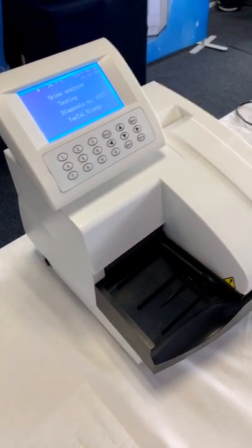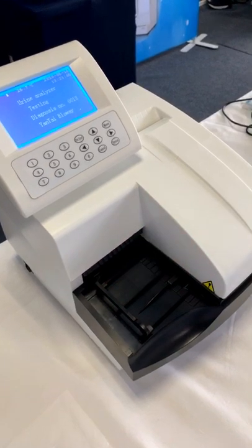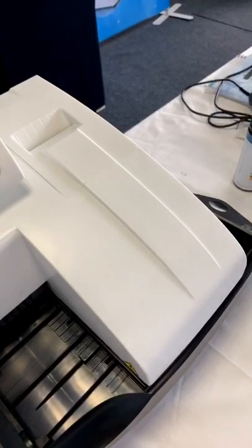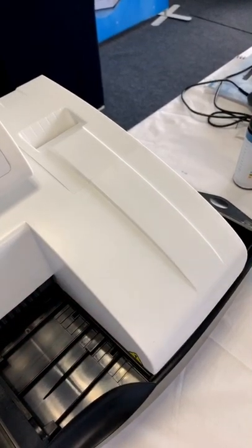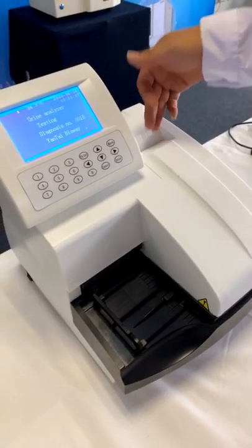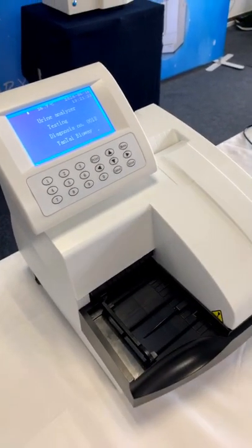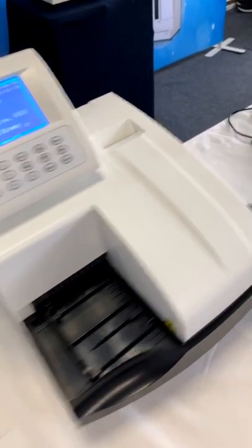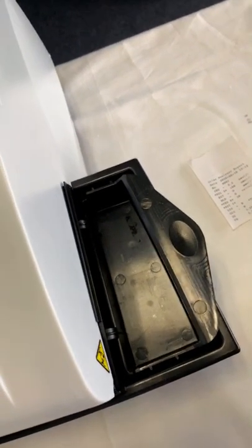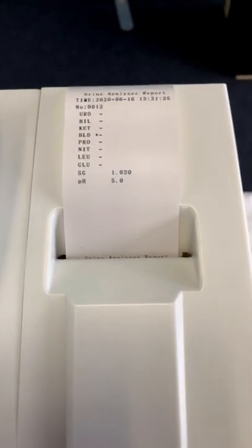So every time it can insert the strip into the machine very well, and in this position there's a strip reader. It will read the strips in different colors and get the final result. After that, we send the result to the printer. When the strip is finished, it will be taken out of the machine automatically. And now we get the printing paper of the test results continuously.